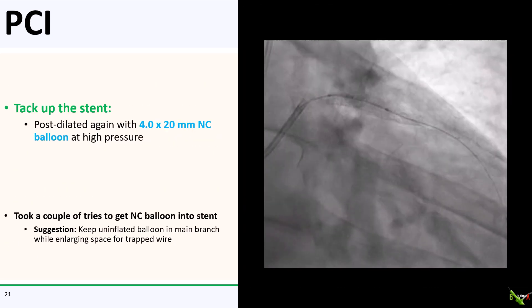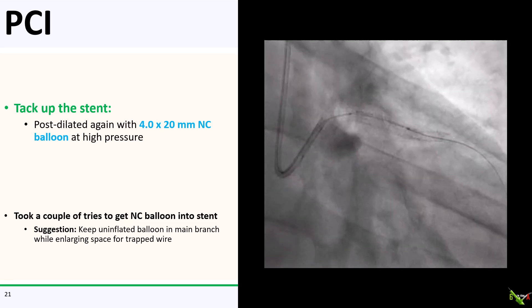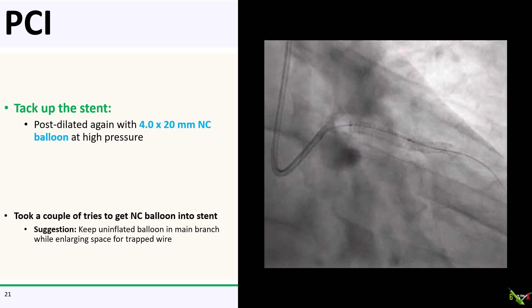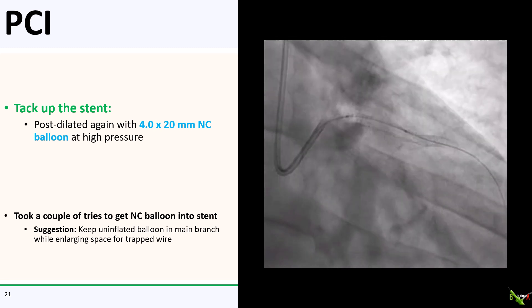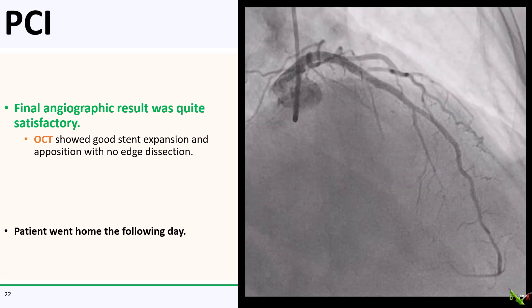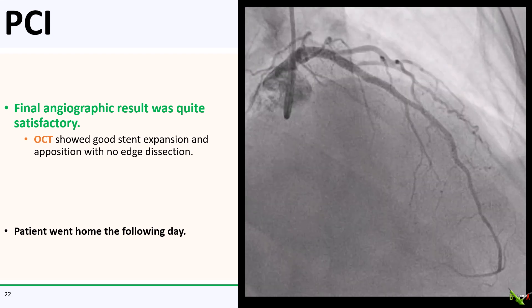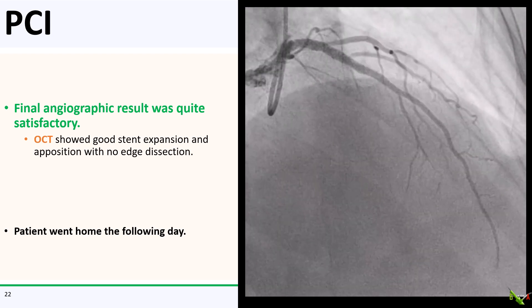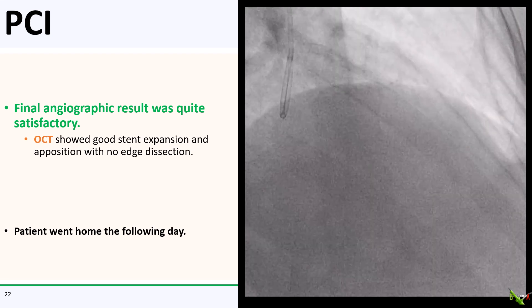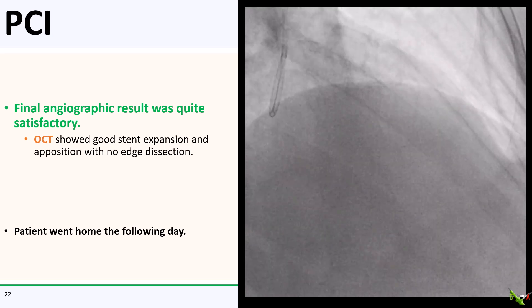I then tacked the stent back up with a 4 by 20 mm NC balloon at high pressure. It was actually a little tricky to get this NC balloon back into the stent — hence my suggestion to keep an uninflated balloon in the main branch while working on the trapped wire. Here is the final angiographic result, which I thought was quite nice. OCT showed good stent expansion and apposition, and I did not see any evidence of a proximal dissection. We watched the patient overnight; she did well and went home the next day.